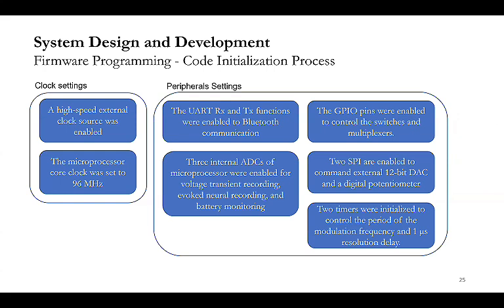And then there are internal ADCs, built into the microcontroller, to control voltage transient recording, evoked recording, and battery monitoring signals. There are also multiple GPIOs to control the switches and the multiplexers correctly.